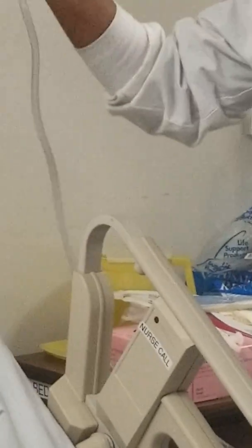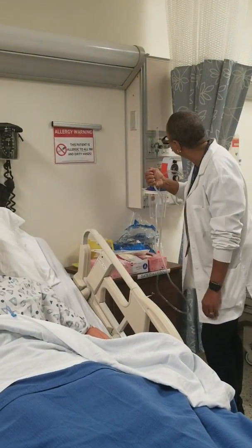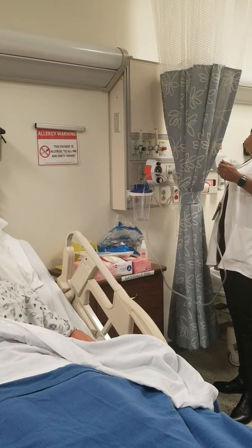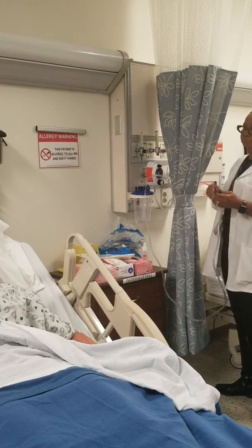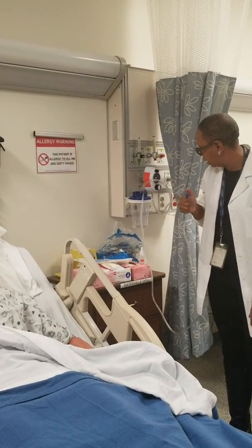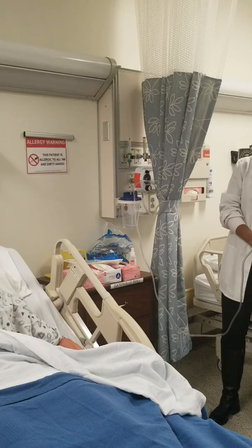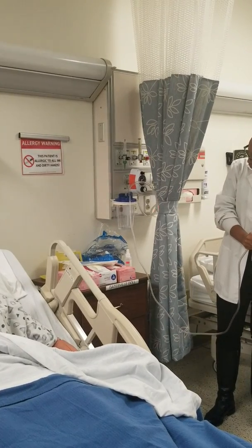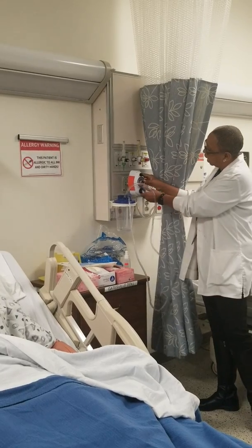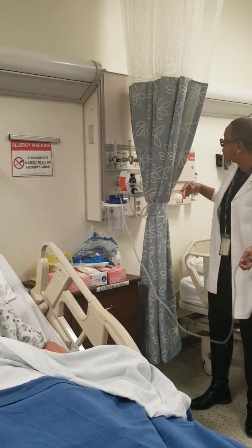When you hear it, it's very loud. Do it work? Just twist the knob. Oh, okay. Well, we won't be doing this long. This tells me if I put continuous suction and it's not high enough, I would have to dial it up until I get to 100 to 120.